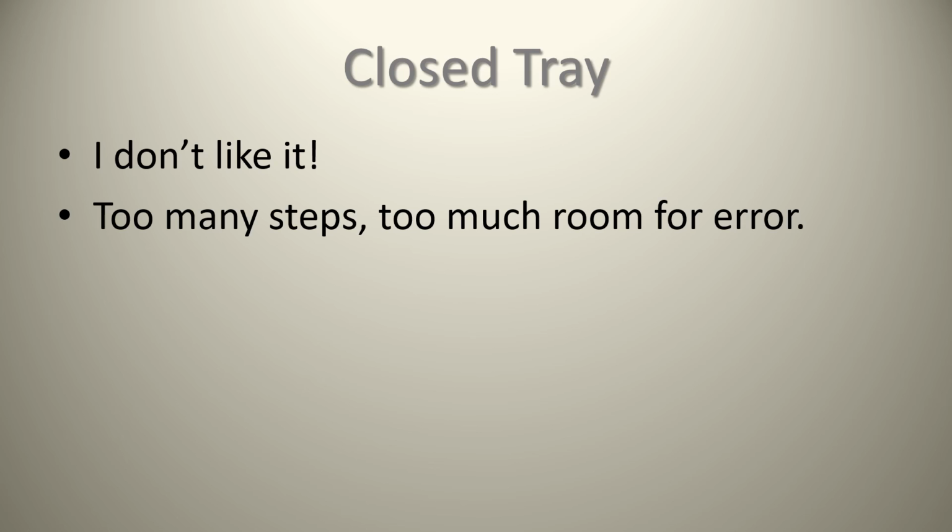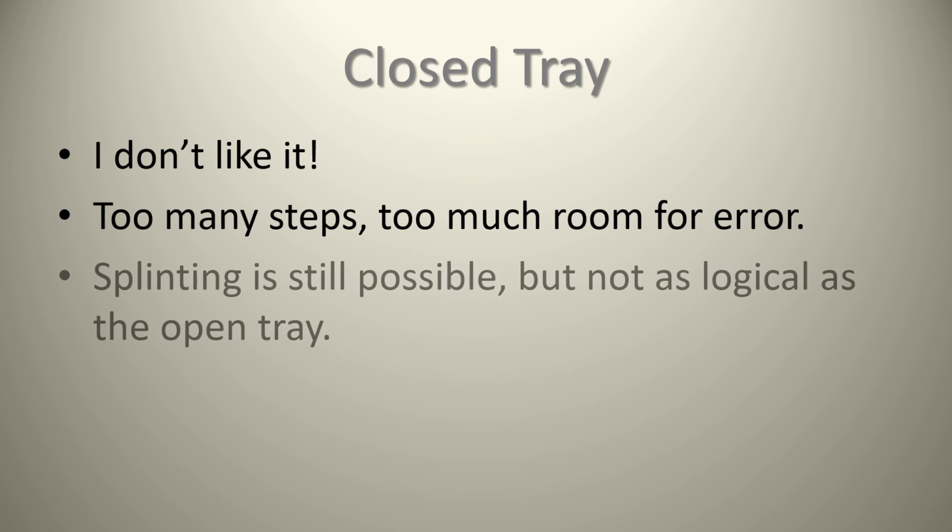Another problem with the closed tray technique is it's not necessarily the friendliest for splinting. Splinting of the impression copings, if you're doing two implants side by side for, say, a bridge, it's still possible, but not quite as logical as the open tray technique, as you'll see later in this presentation when we talk about splinting of impression copings.